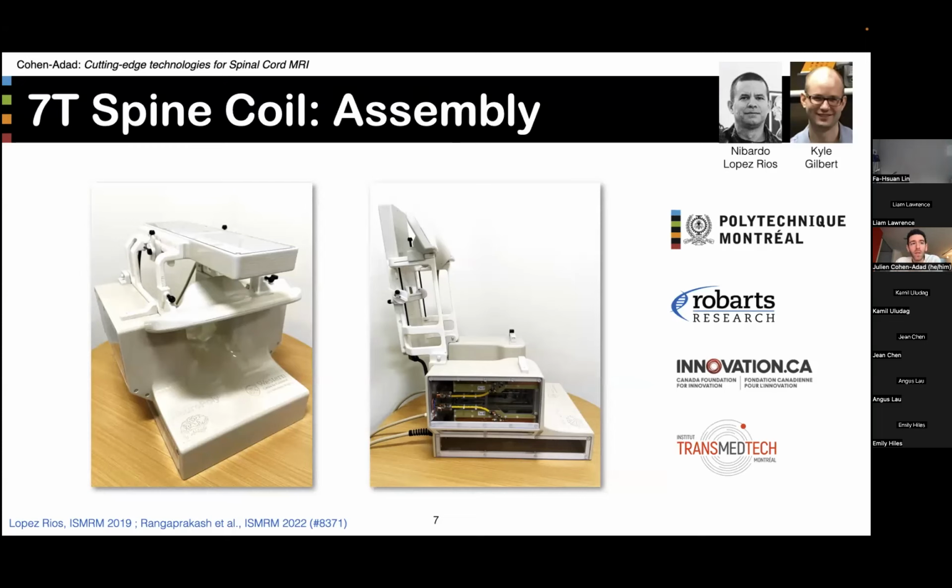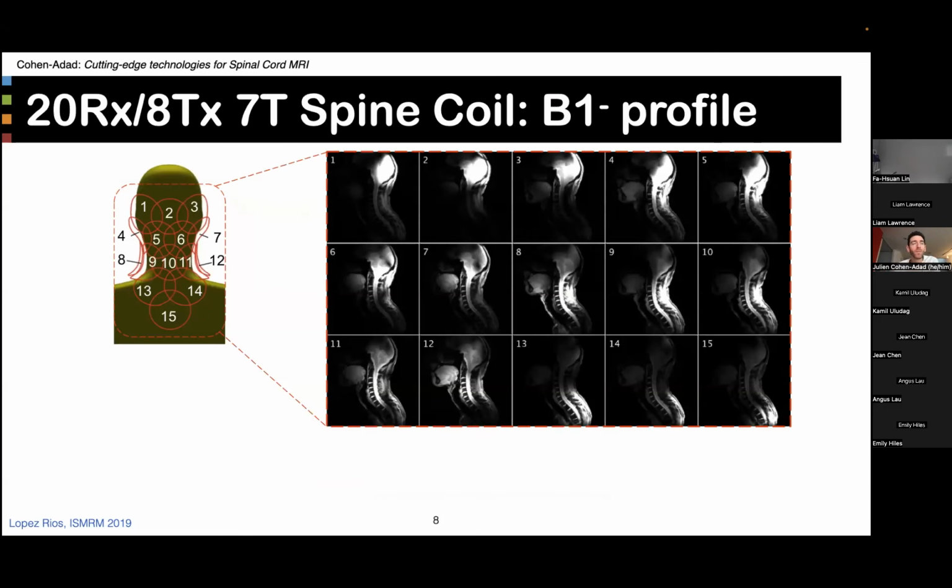His team is using the coil for fMRI applications. It's nice to have the same coil at 2 different sites to also assess replicability of the results.